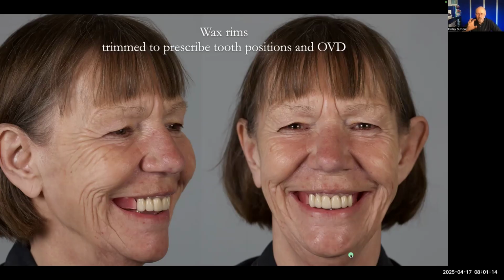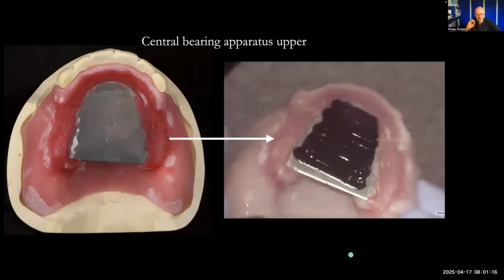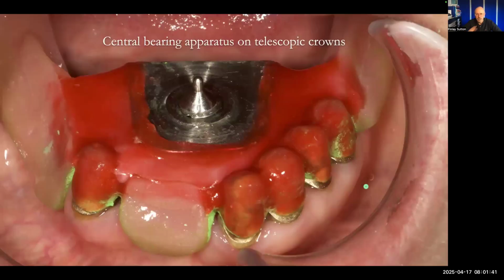So the next part of the appointment is I want to just record really accurately CR. This is a base plate that's made to the working cast at the top there. And then on that base plate, I warm it with a Bunsen and then using a China graph wax pencil, put that onto that plate, let it set, and then take that to the mouth. So I fit the lower one down first.